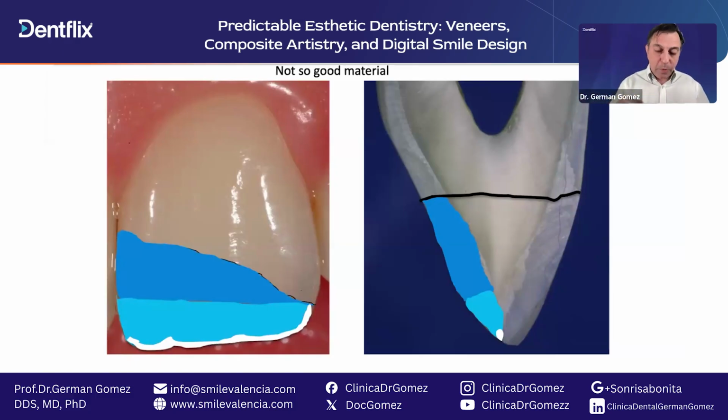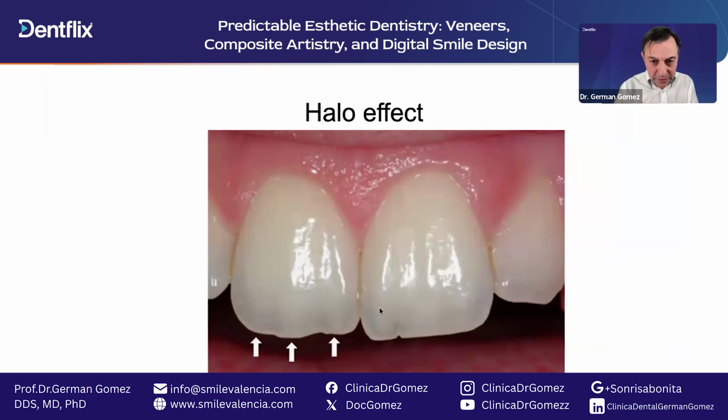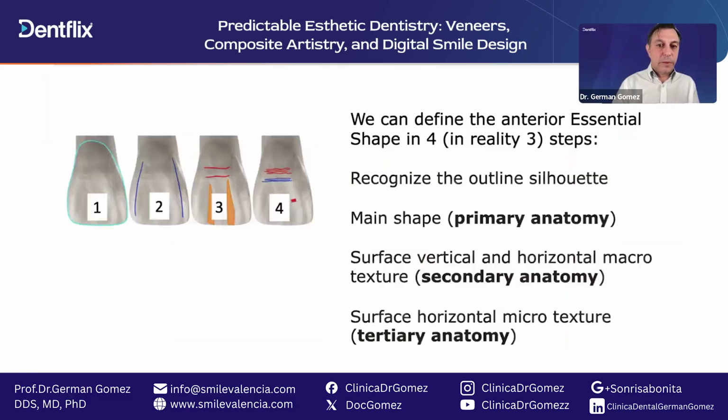It can be flowable composite, can be a normal whitening composite at the really incisal edge, but from the back, and then dentin, enamel, and transparent. Okay, and then we have a nice halo effect. Good. The halo effect here, you see these whitish areas. Okay, good. We can also paint it with bleaching color.